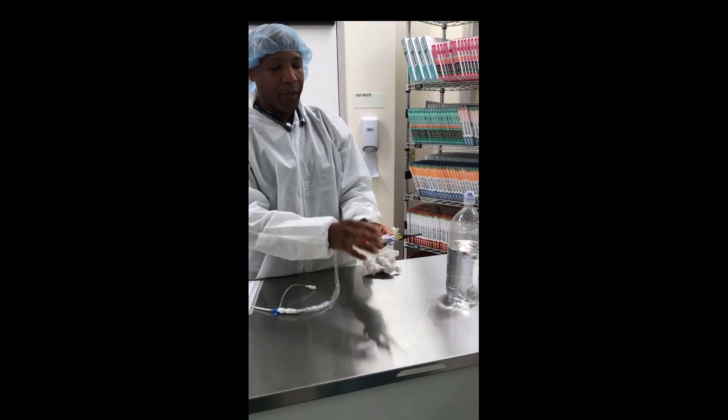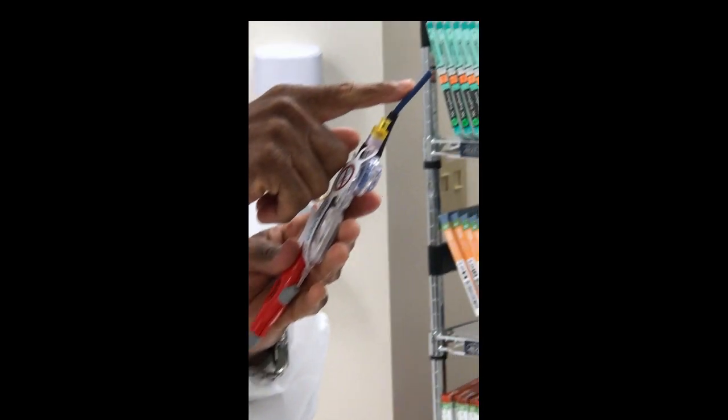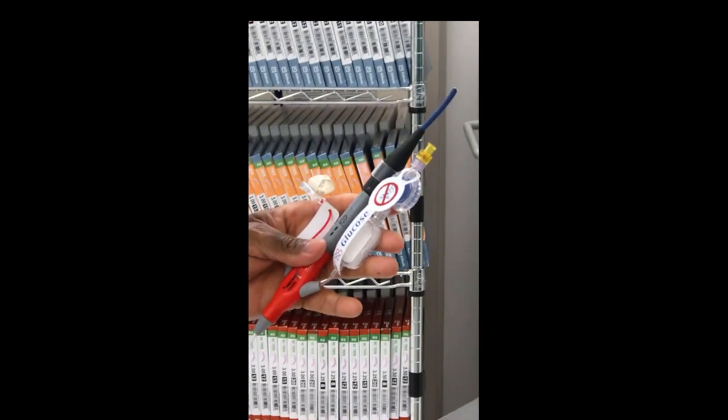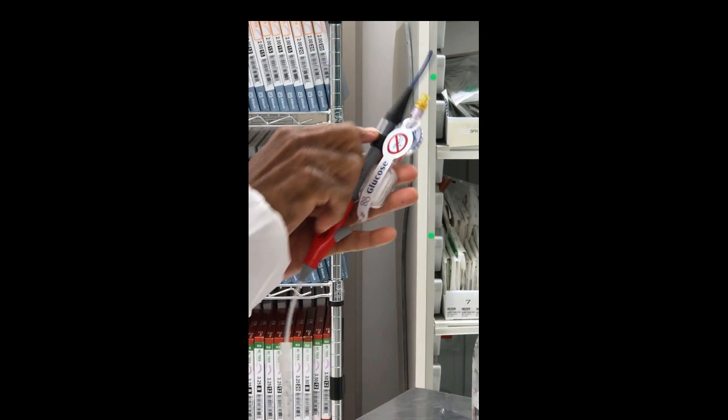At the back end — the part outside the body — there are three components, I call them the three P's. The first is Performance. This is an electrical connection that allows the propeller to spin to create the drawing force. This power cable connects and gives us all of our performance pieces.